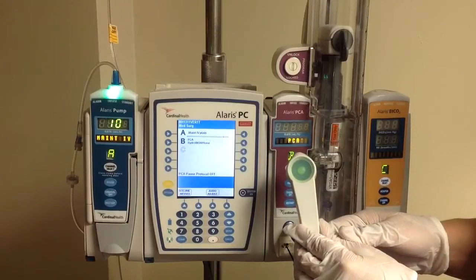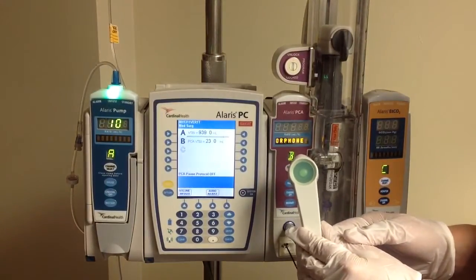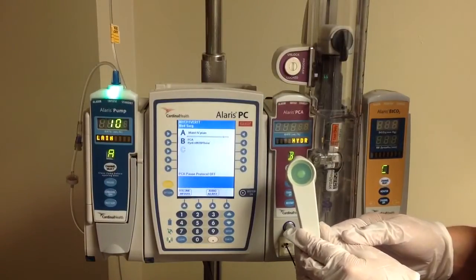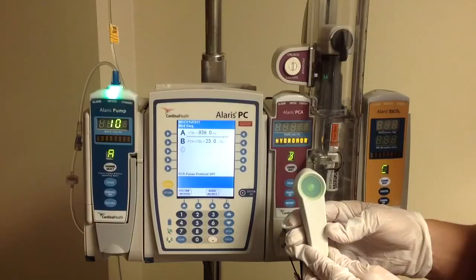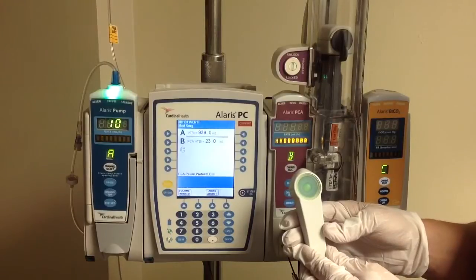So that lets the patient know that they don't have a dose available. This is a good time to talk to the patient, do a little teach-back — ask them to explain to you what this device is for, and explain to you about the light and when they can and cannot have a dose. That way you can be assured that when you're looking at the history, the patient understood how this functions.